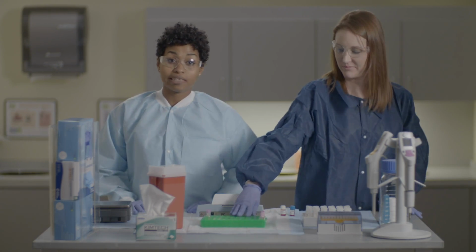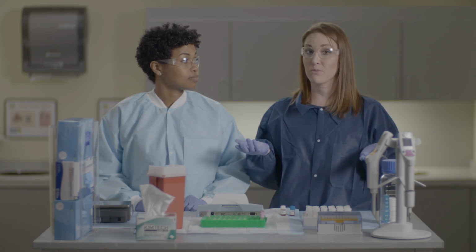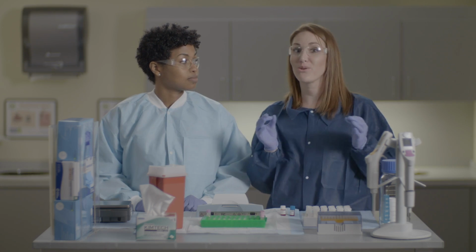Everything you do, right or wrong, when drawing blood shows up in the lab. Contamination is a huge risk when you're measuring an amount as small as 3.5 micrograms per deciliter. The critical thing is to keep extraneous lead out of the sample in every way possible. When you do each of these steps we just saw, you realize that each one is critical in eliminating a possible source of contamination. Right. Each one is like another line of defense. And you need to do each one right because you're working with such a small margin of error.